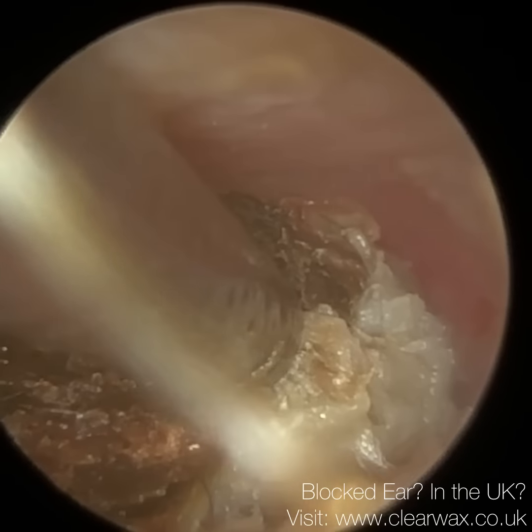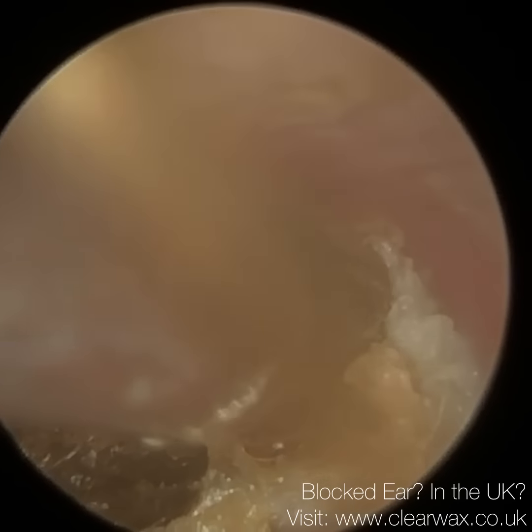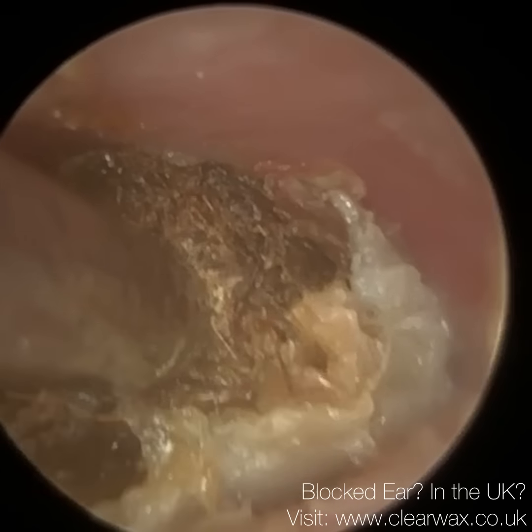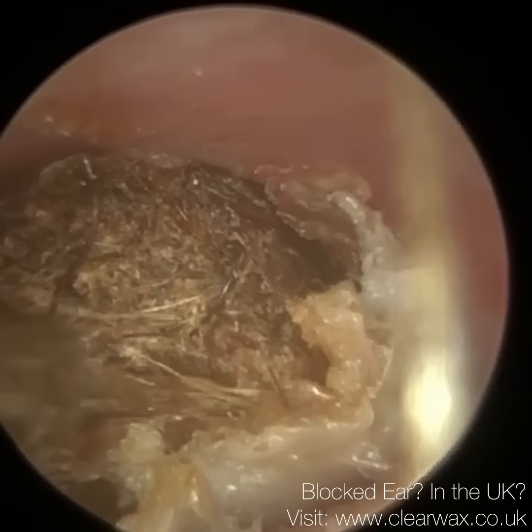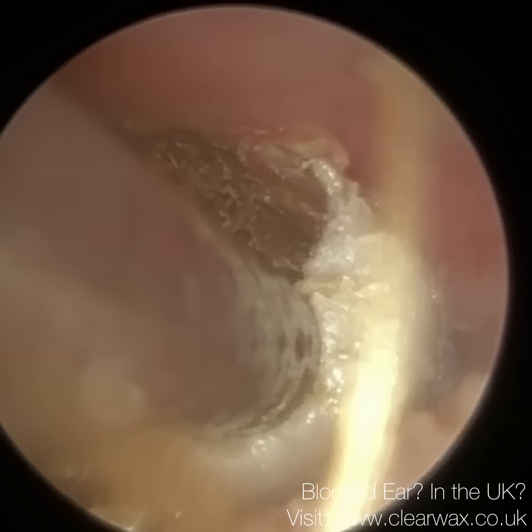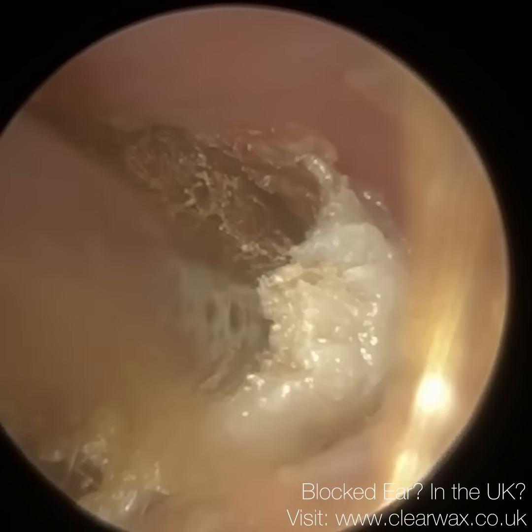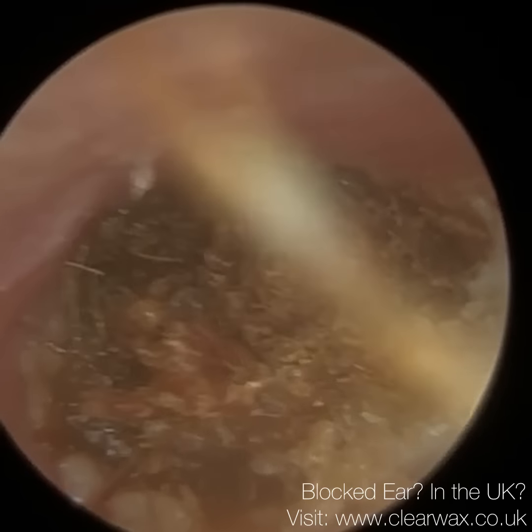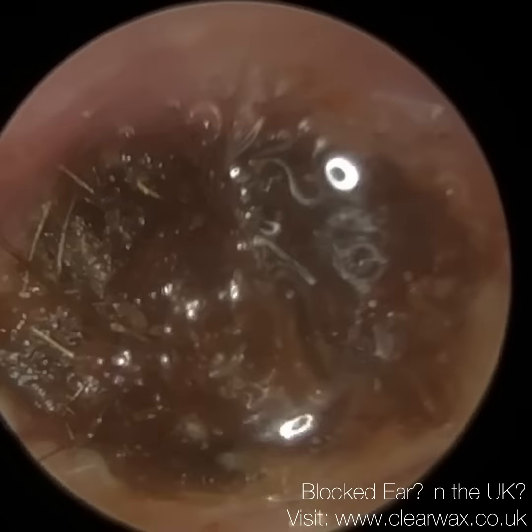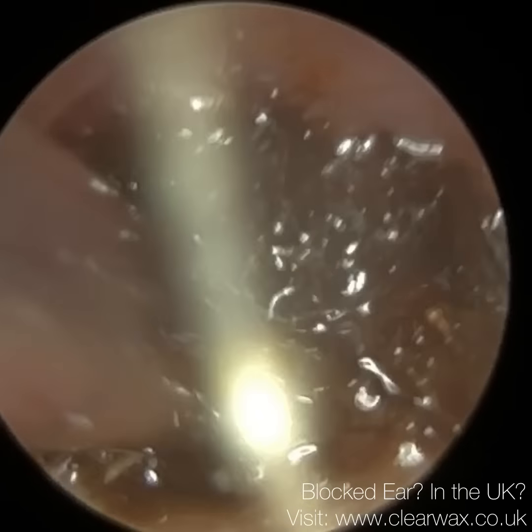This is where you can see the white layer, which is the peripheral matrix. That's the most recent layer of skin that's attached itself to the keratosis obturans. It's a really, really thick layer, and this is really compressing against the canal wall, and that's why there's some granulation tissue formed. Now, normally when you have granulation tissue with the keratosis obturans, you classify that as a grade 3, but the widening, so it's probably a grade 2 stroke grade 3. You can see some granulation tissue on the left-hand side, the anterior canal wall as well. But I would normally expect more of a widening of the ear canal.